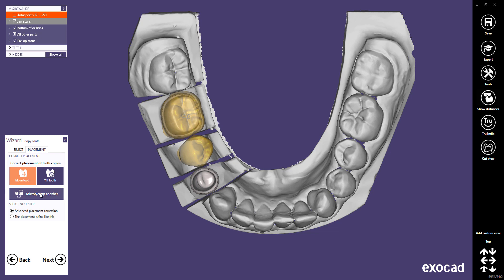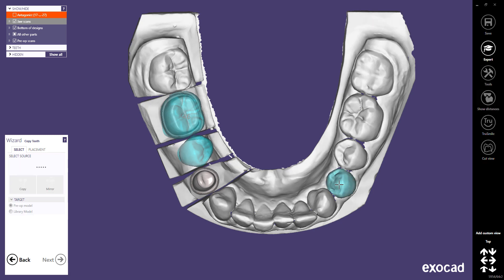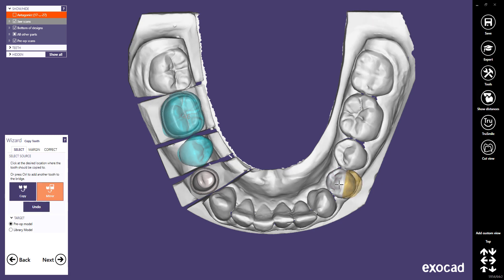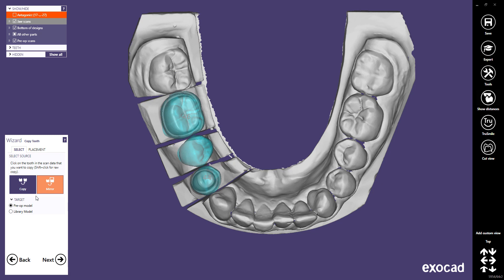Click Mirror Copy Another again to mirror the last tooth and repeat the same steps. If you made a mistake or want to change a tooth copy, click the Change Copy of Tooth button. The Select dialog will be restarted and you can replace a copied tooth with another tooth.